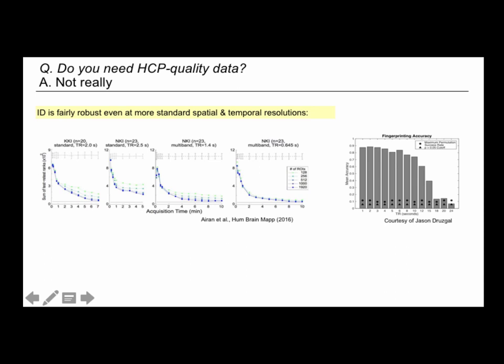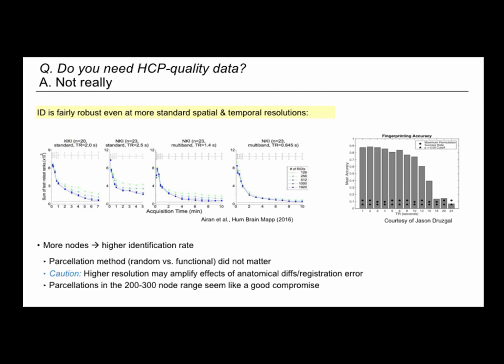they're artificially downsampling by a large factor the TR, or the temporal resolution. And so they find that even taking only about every 10th image, every 10th volume, and calculating connectivity matrices that way, they're still able to get a really good accuracy, and this only really starts to drop down after about 12 seconds. So it seems that this identification is fairly robust to those things.